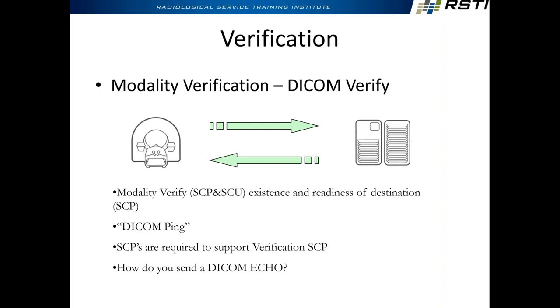How does PACS keep track of all this stuff? There's a database on the PACS. Well, what's the unique identifier that is going to be used? Every hospital has one, right?